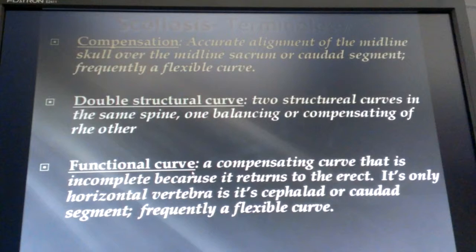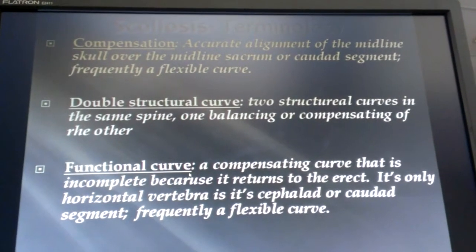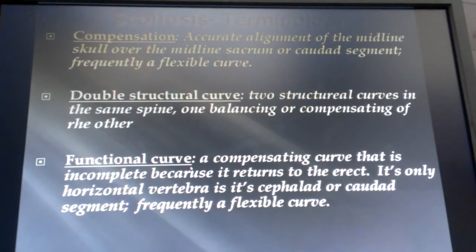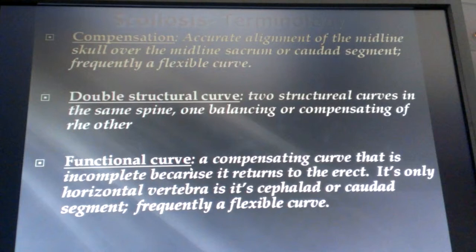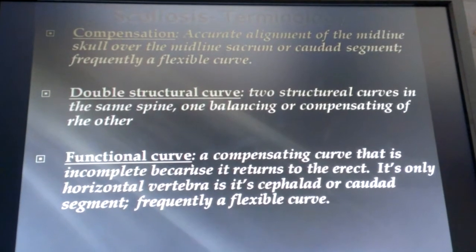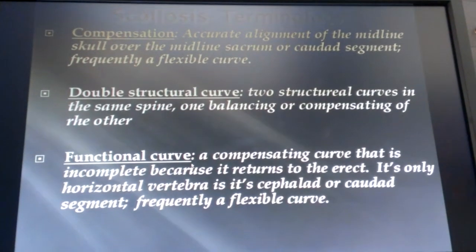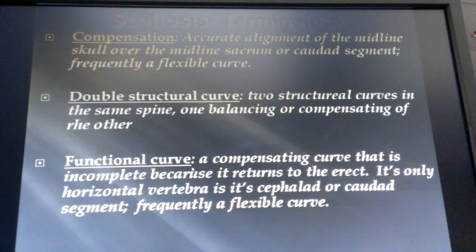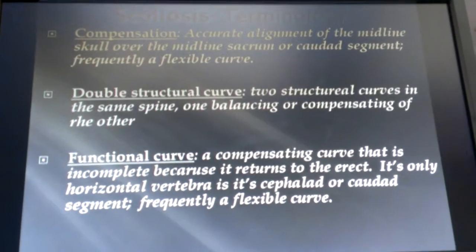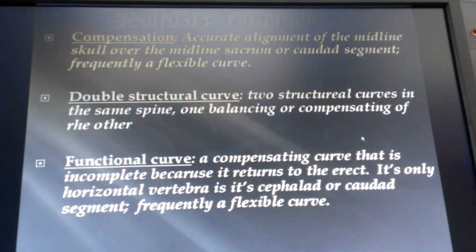And realize there are different types. You can say it's iatrogenic. So the patient that maybe had a lumbar fusion might end up with a scoliosis. They will definitely end up with hypermobility and degenerative changes above where they did the arthrodesis or the fusion. But you can have pathological because of a tumor, or you could have traumatic. I mean, there's all kinds of possibilities. And definitely congenital.